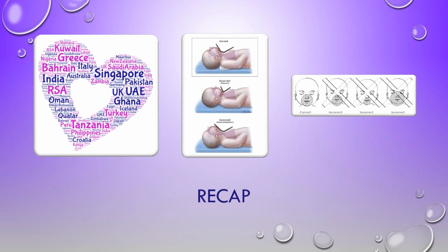You can see in this top drawing here that they've put this towel under the baby's shoulders, and that gives you the correct positioning. It's very important that in preparation you have that towel ready. Here you can see how the airway collapsed, and in this one you can see how the airway is over distended, and you won't get decent aeration there either.